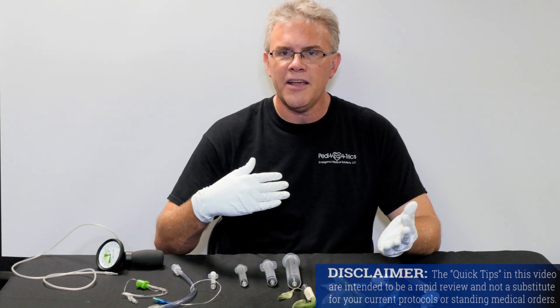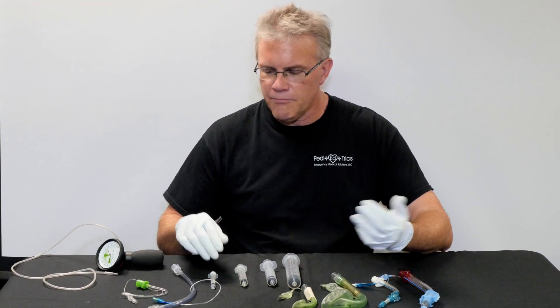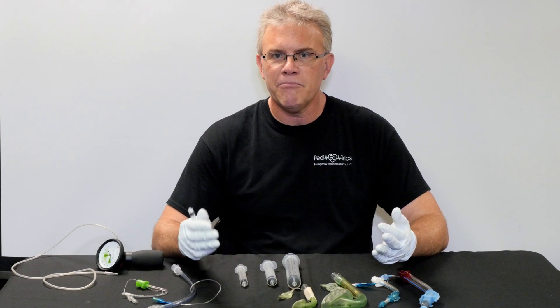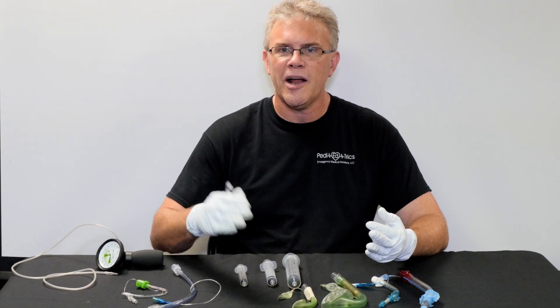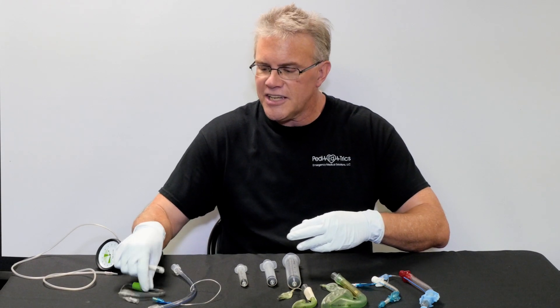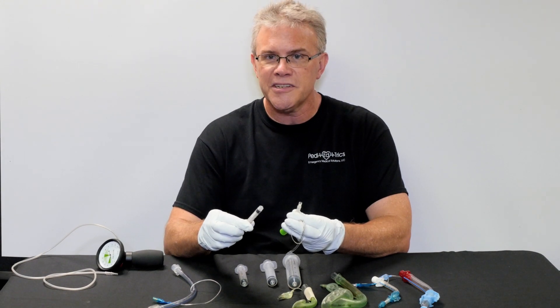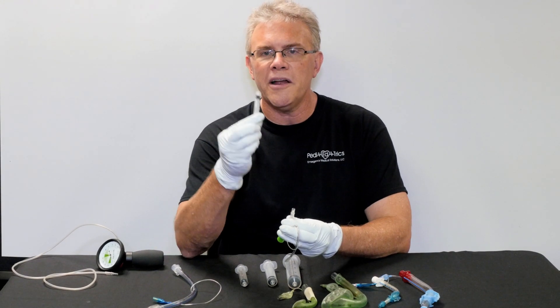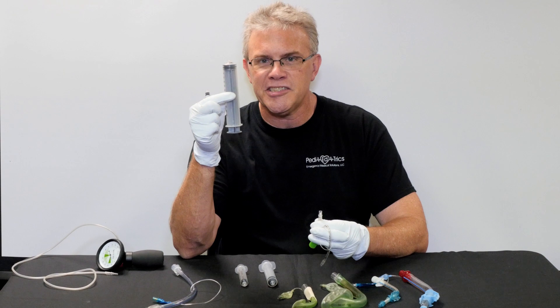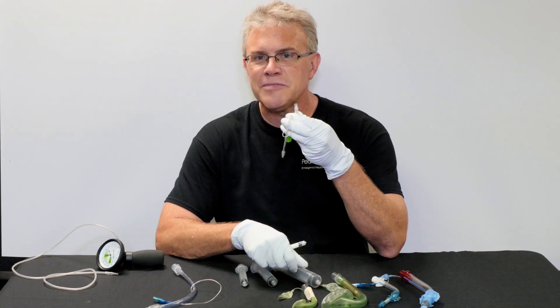So if you place the airway and somebody else is going to inflate it, here's tip number one: don't just give them a syringe. Put some thought into it and give them the correct size syringe. Because if you're going to inflate a little tiny endotracheal tube, remember all it's going to take is a CC, maybe two at the most. Only give them a tiny syringe — don't give somebody a 60cc syringe for a little tiny tube, because bad things will happen.